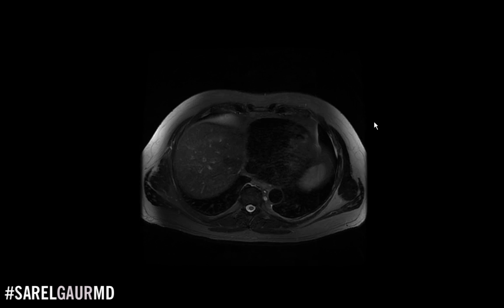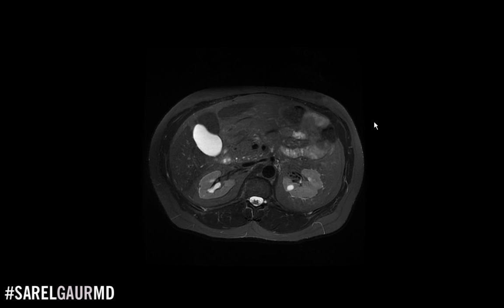Scrolling down to the next set, again I'm asking: is this T1 weighted or T2 weighted? My eye is picking up a lot of bright signal here, and there's some signal in the gallbladder, the calyces, and fluid around the spinal cord. So I know immediately this is a T2 weighted image. Is it fat saturated? Yes — I'm looking at the subcutaneous fat here, and that fat is low in signal, so this is a T2 weighted, fat saturated image.